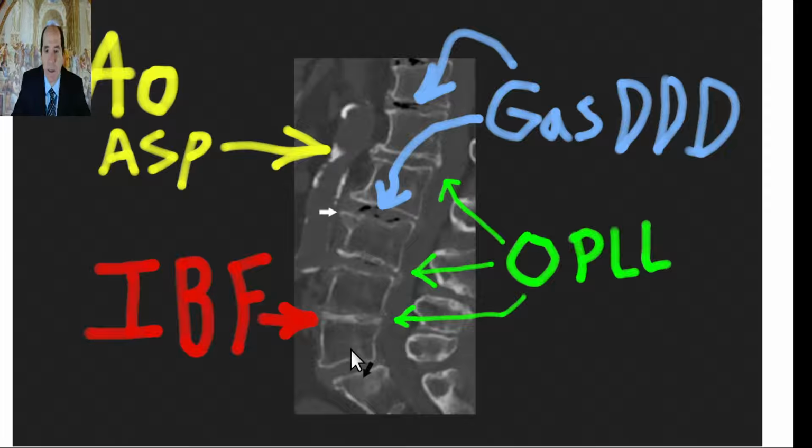This would be pretty typical for a guy over 80, but if somebody is younger, then they would have accelerated degenerative disc disease of the spine. But it's routine for guys over 80 to look like this. Many people in their 70s look like this, and even some unfortunate people in their 60s look like this. Okay, and this is a terrible looking spine. This person's not too functional.